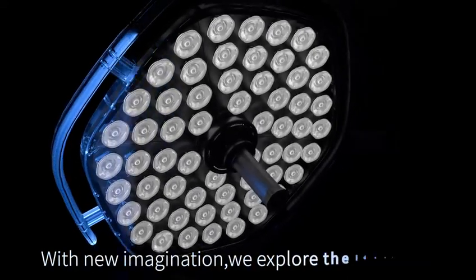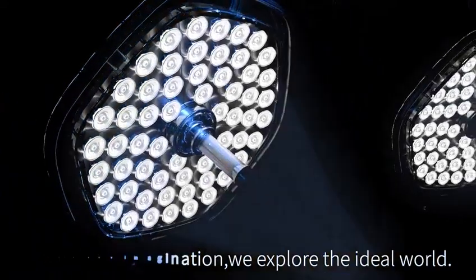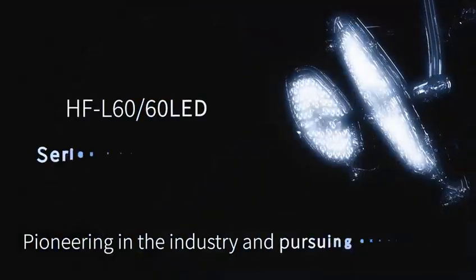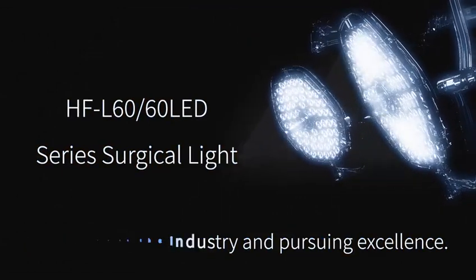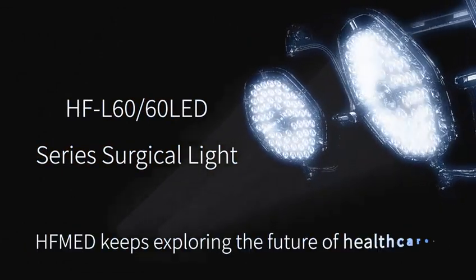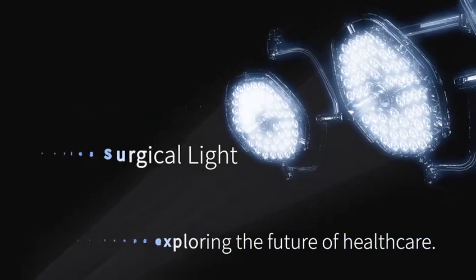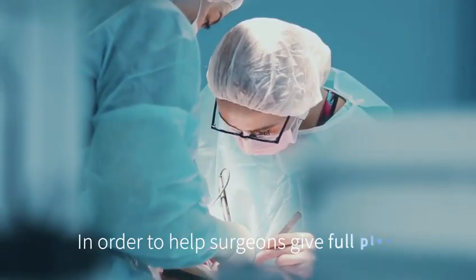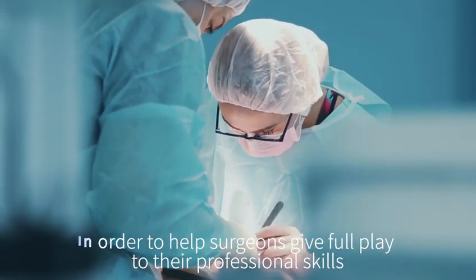Human's pursuit of health never stops. With new imagination, we explore the ideal world, pioneering the industry and pursuing excellence. HFMAD keeps exploring the future of healthcare in order to help surgeons give full play to their professional skills.